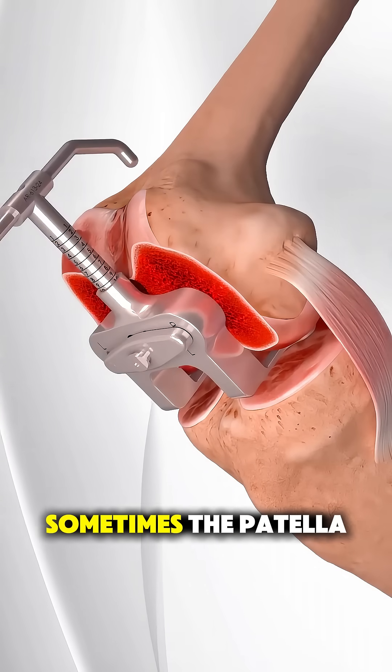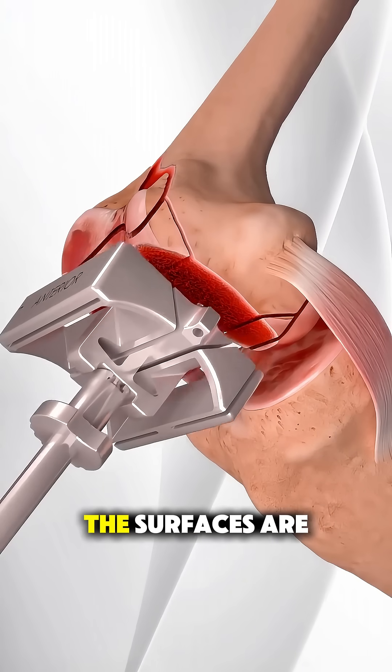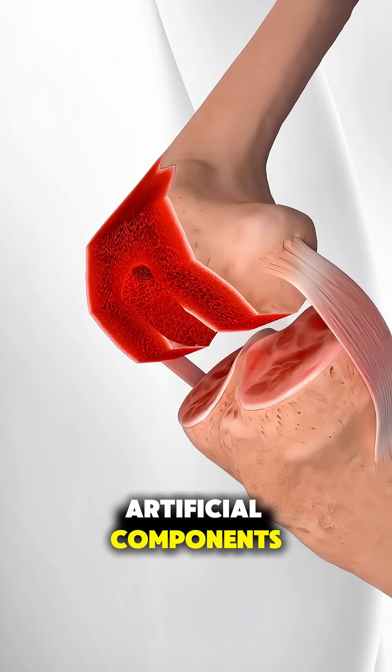the shin bone, and sometimes the patella, the kneecap, are carefully removed using precise instruments. The surfaces are shaped to perfectly fit the new artificial components.